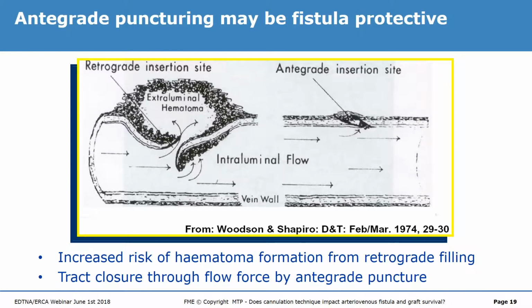44 years ago, do not forget, because still today you have some people in favor of the retrograde puncture of the arterial needle. This is something that you should do only if you do not have any other possibility.